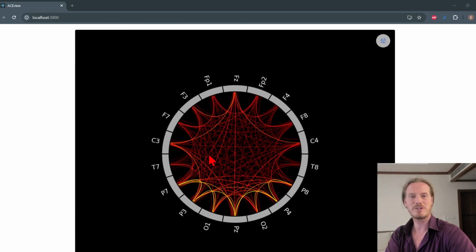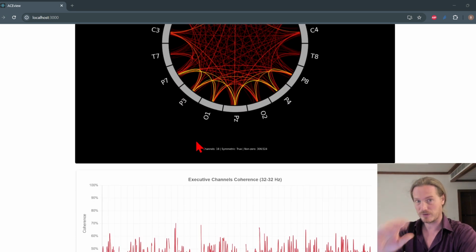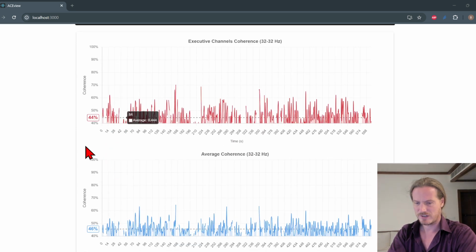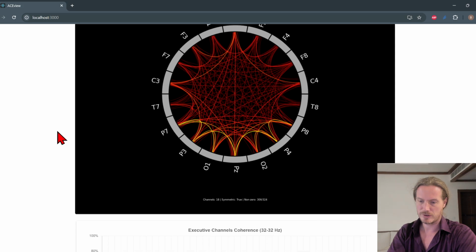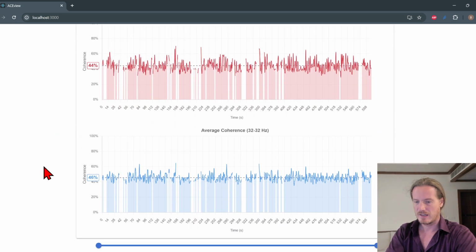So all of a sudden we see a lot more lines that were hidden earlier because we set the threshold at 70%. And we set the gradient also starting from 70 to 100%. So now we have these charts here, and of course they're lower because that's the nature of it. And I can change that here to, instead of 40% to 100%, 0 to 100% on the Y scale. So I've changed the scaling here.